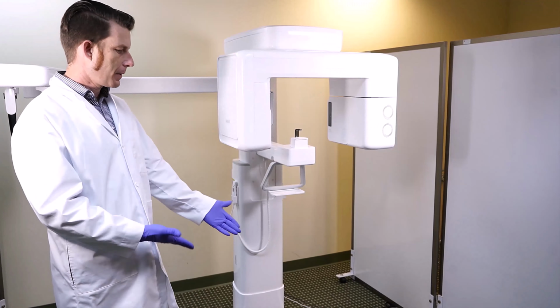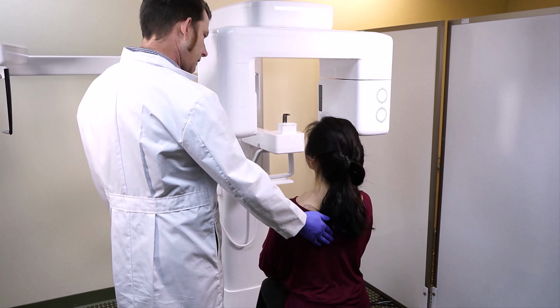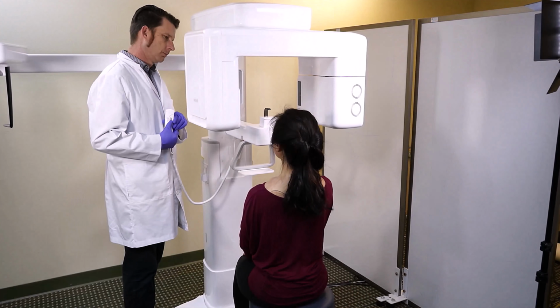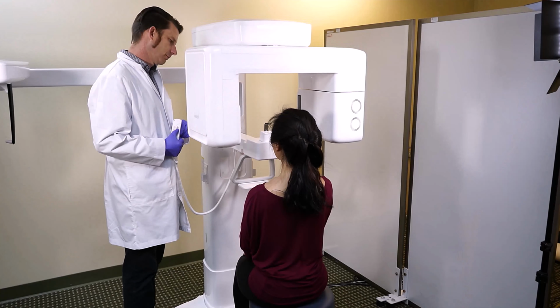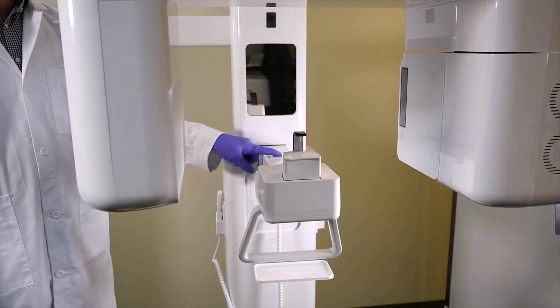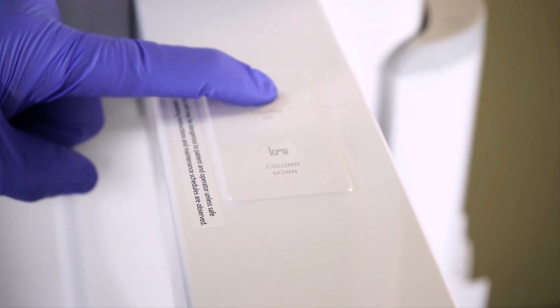First, have your patient seated, sitting as upright as possible a few feet away from the machine. Adjust the chin height approximately a half inch under the chin by using the column up and column down buttons on the hand switch on the side of the device. Alternatively, you can use the buttons on top of the horizontal arm in front of the mirror as well.